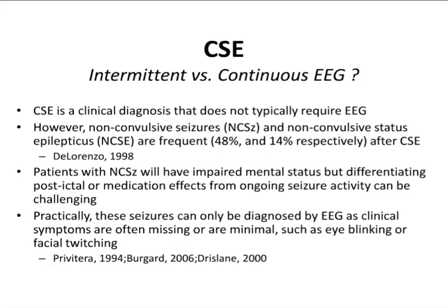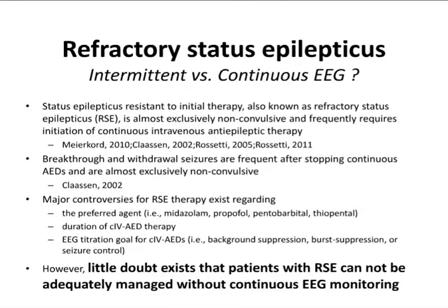Patients with non-convulsive seizures will have impaired mental status, but differentiating between a post-ictal state, the effect of sedatives, or medication like benzodiazepines, from ongoing seizure activity can be challenging. So in practice, to detect these seizures and to distinguish this impaired status of consciousness, you need EEG.